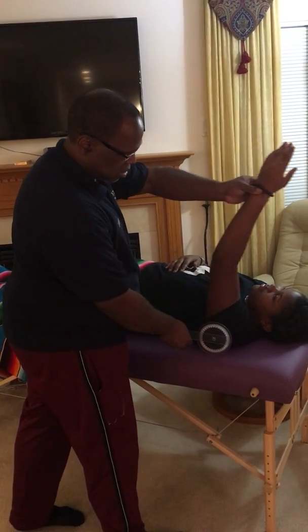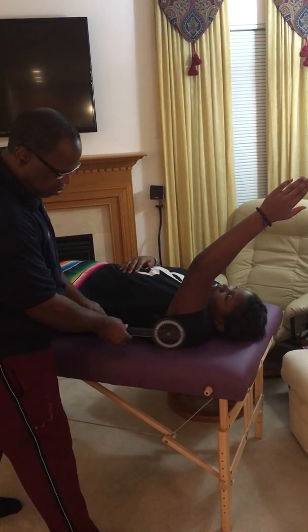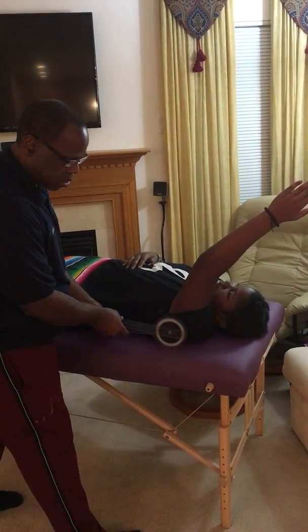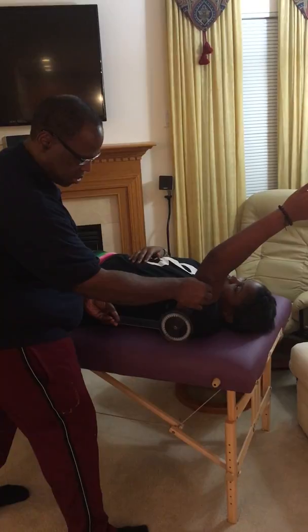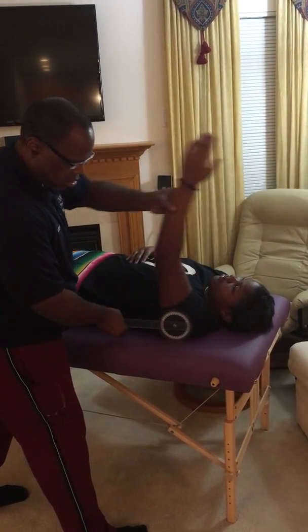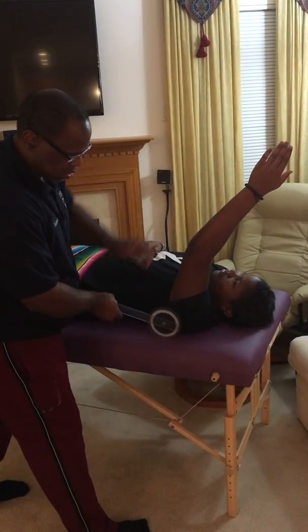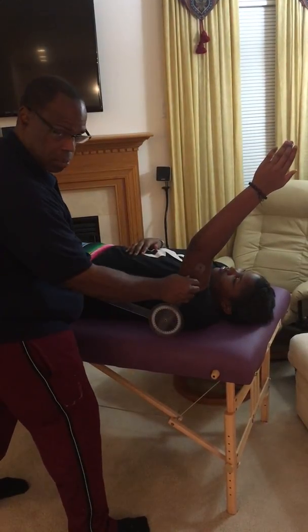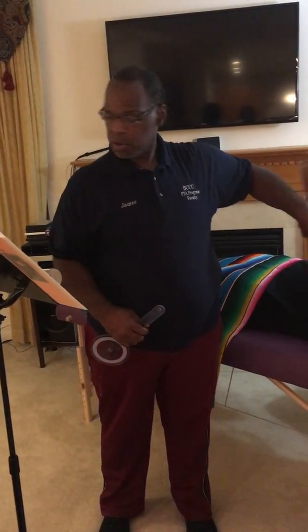And if the patient just holds their arm in that position, then I will take the goniometer and move it from the closed position to that arm right there. So again, this is an example of the goniometer starting in the closed position and then moving to wherever that body part moves. All right, that is number 2.